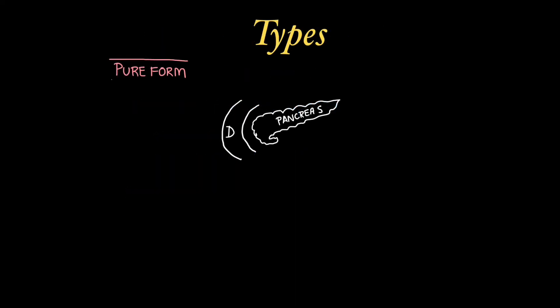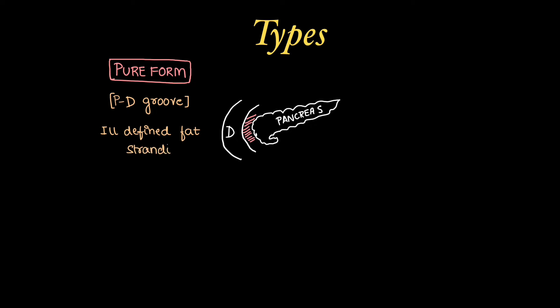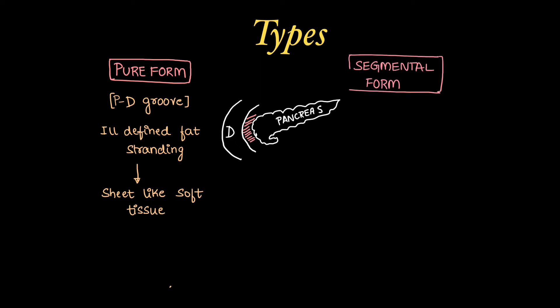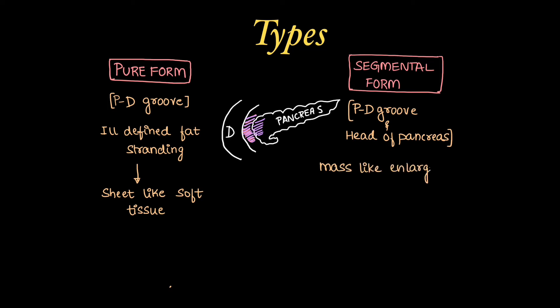Coming to types of groove pancreatitis: there is the pure form, as shown in the case previously, which occurs only in the pancreaticoduodenal groove, ranging from ill-defined fat stranding to a sheet-like soft tissue density in the PD groove. Then there is the segmental form, which involves the pancreaticoduodenal groove but also extends to the head of the pancreas, and can present as mass-like enlargement of the head of the pancreas.